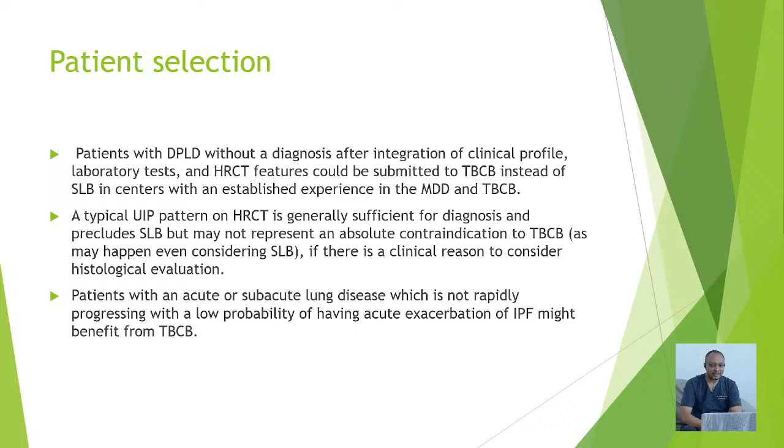The key thing in a successful program is proper patient selection. This will mean that you select those patients in whom you are likely to get a diagnosis. Number two, you select patients who are low risk for the different complications that we talk about below.